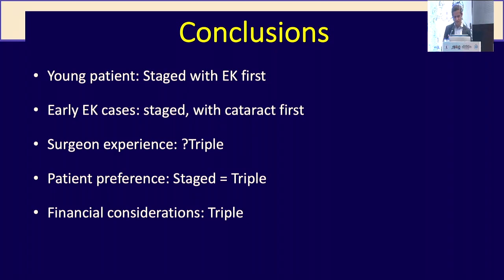And financial considerations, definitely, as Tony said earlier, 95 to almost 100% of my patients who are more than 60 or so have some cataract, I'll go ahead and offer them triple instead of staged because of financial considerations as well.